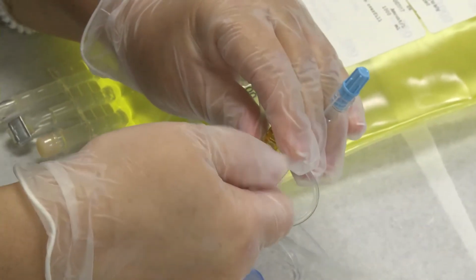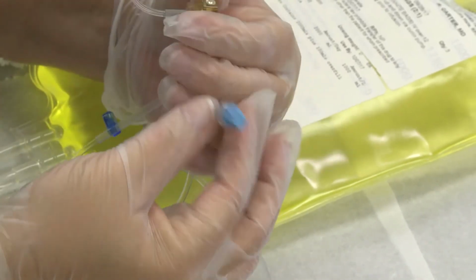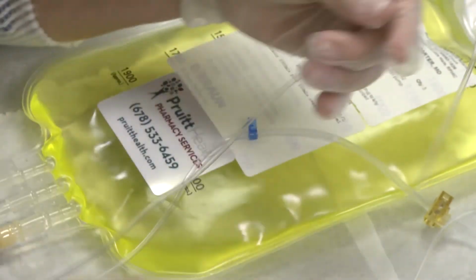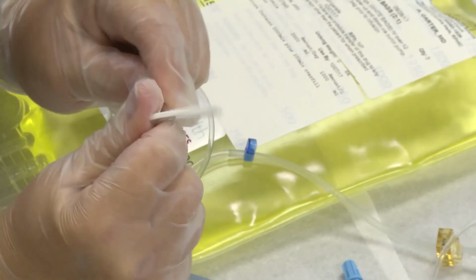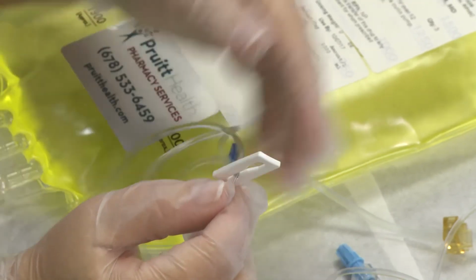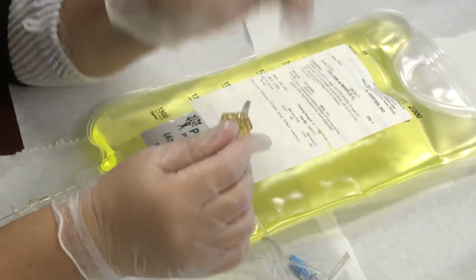And I'm going to come up here and I'm going to pull off this yellow cap. When I do that, it mashes down on the tubing and clamps it, and it stops dripping. There's another clamp on this tubing also, this white one. This white clamp will slide across on the tubing and pinch it. So now I've actually clamped or pinched this tubing two different ways. One way with this and one way with this. You have to take off the little yellow tab I pulled on this in order to get it into the pump.